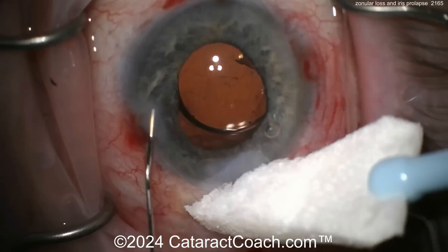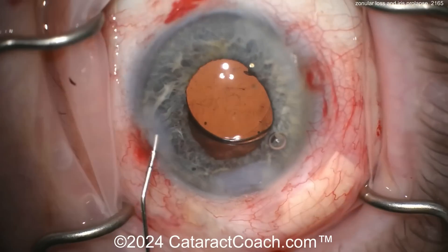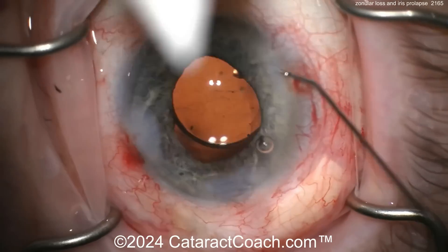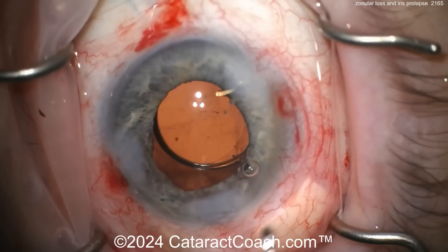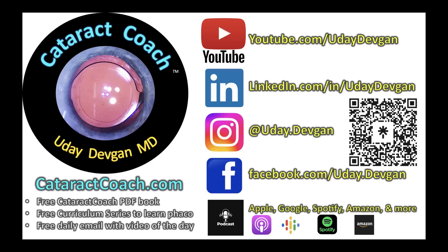Is it reasonable enough to leave it like this now, where the lens looks like it's a little de-centered? Yeah, as long as you're sure there's no vitreous in the anterior segment. You can always come back another day and do another procedure. What a tough case! Remember, check out our podcast — available everywhere you find podcasts.